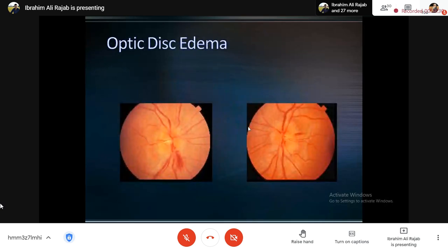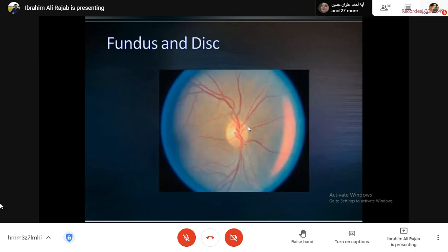شكرا أهلا. يلا إيان أو أيان عبد الحسين. دكتور بس العفو بالنسبة لسؤال الصورة اللي قبلها. نعم بس قولي لي اسم حضرتك لأن أنا ما دابا على اسمها. أمنية. يلا أمنية. دكتور بس هنا بهاي الصورة مال الفندس اند الديسك هنا المفروض إنه ما بين الماكيولا مو صحيح؟ صح. The macula is not so clear.